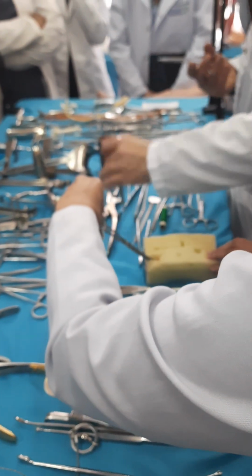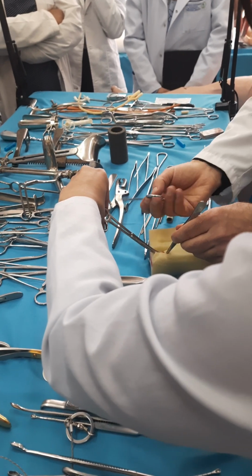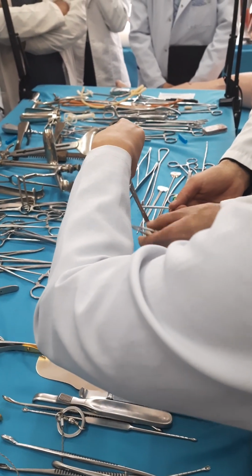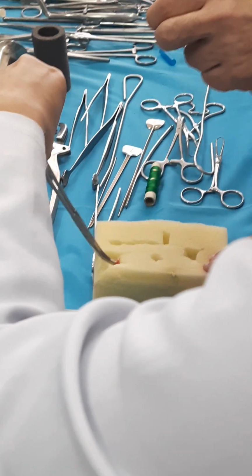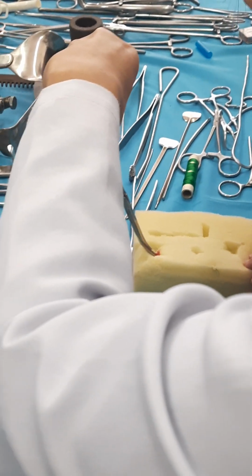Of course, I need here also the dissecting forceps. I will fit. Now she will lift the instrument a little. No, lift it means you must lift it, but hold it here. And I provided below this the dissecting forceps. I'm very sorry, it doesn't give good fixation, so I will change my instrument. That is much better.